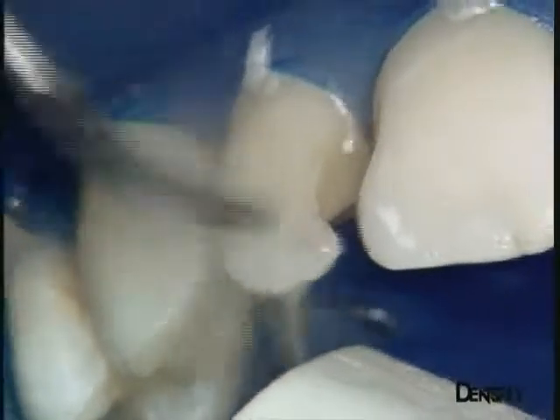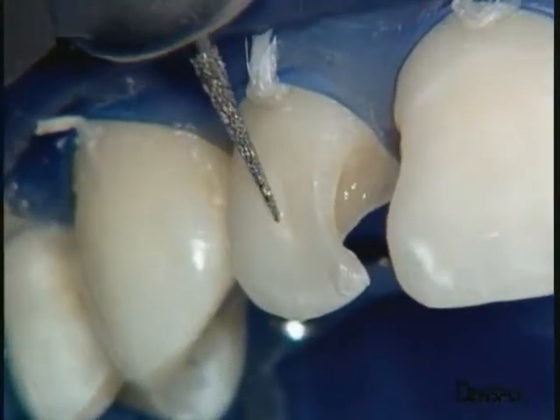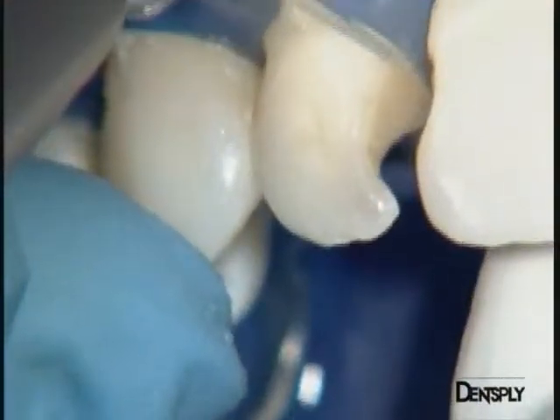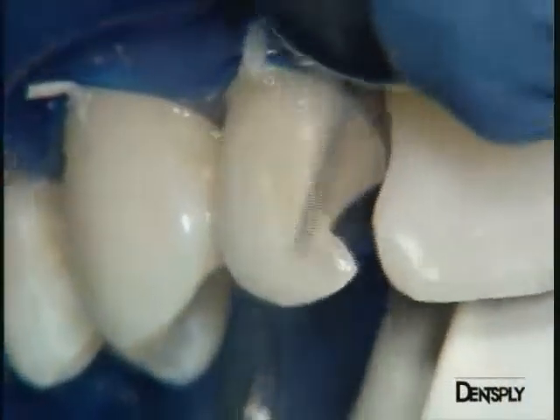There is now a decision to be made about the extent of this restoration on the vestibular face. Should the preparation completely surround the old composite on the vestibular face? We think this is the only way to avoid a visible line between the two restorations. A long frontal bevel is therefore made, going beyond the old composite.